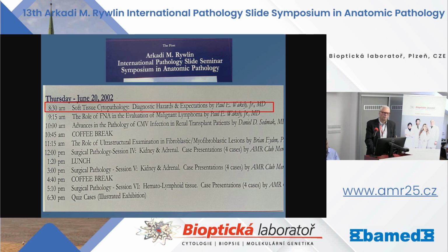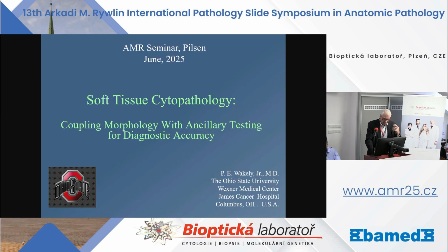Most of this is my own personal experience. The title of the talk is Coupling the Morphology with Ancillary Testing for Diagnostic Accuracy by using fine needle aspiration biopsy for mass lesions of soft tissue.